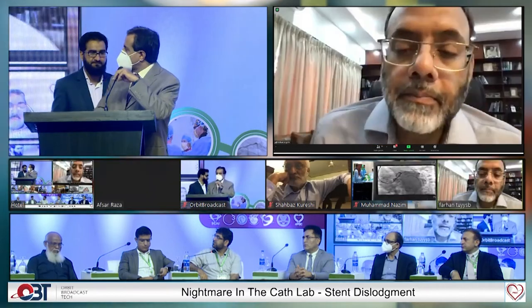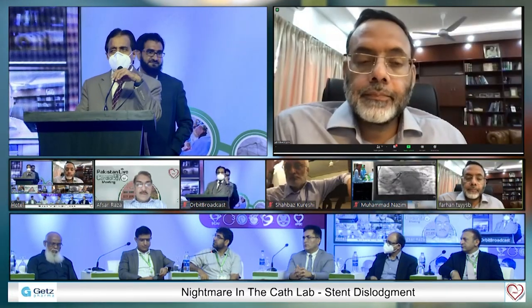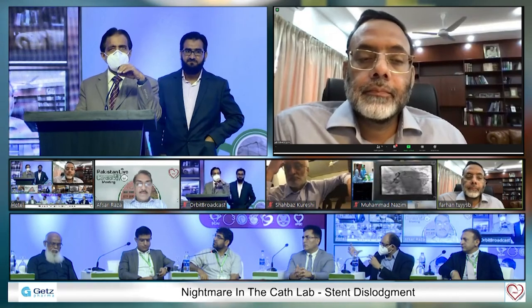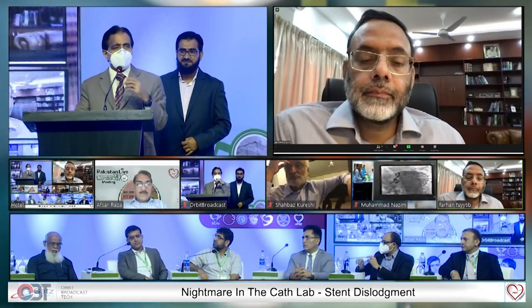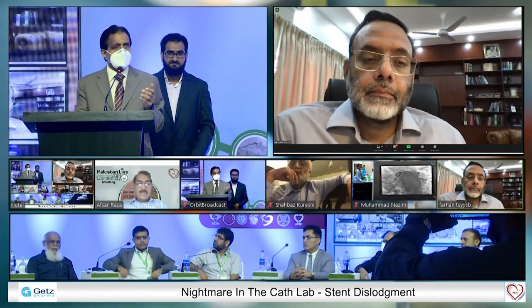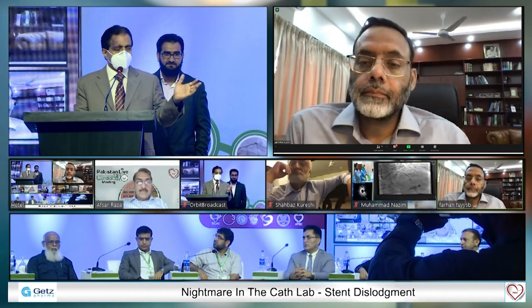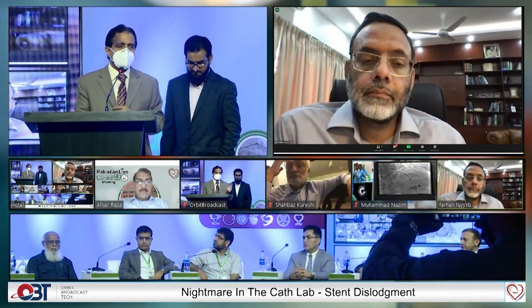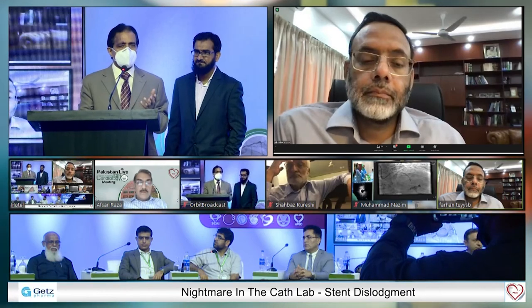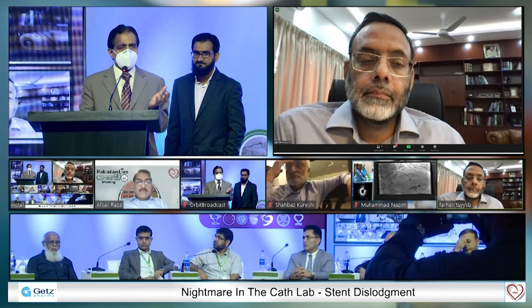Just a very quick comment. I think Kaleem mentioned it very well: you need to preempt what can happen. This is a calcified, tortuous vessel, and there are definitely going to be difficulties. In the acute setting, sometimes you can just balloon it or leave it alone and come back to it later. That is one option, but otherwise you really need to prepare it very well to get the stent down.